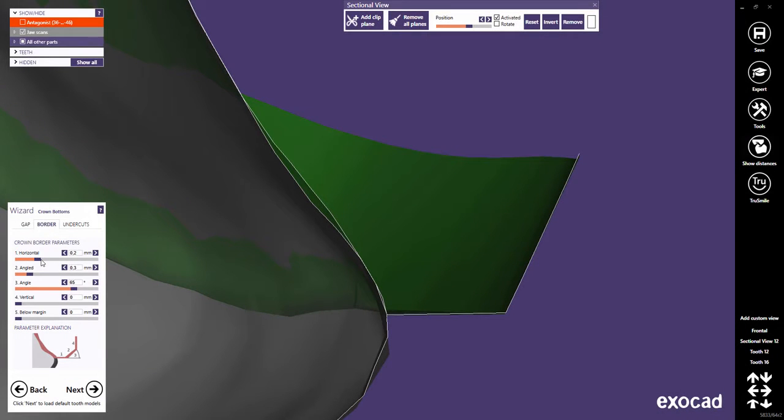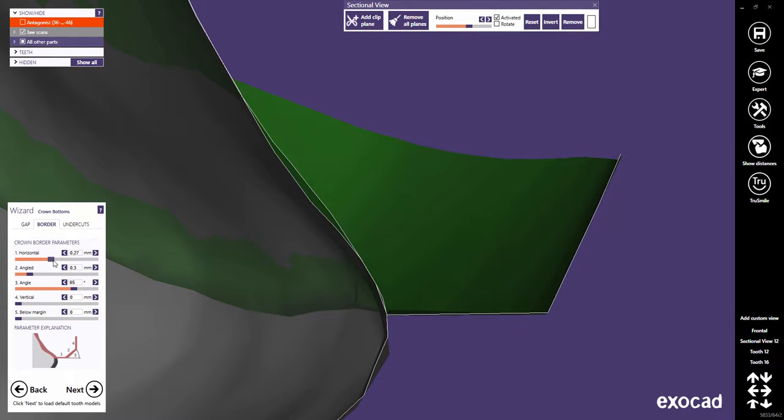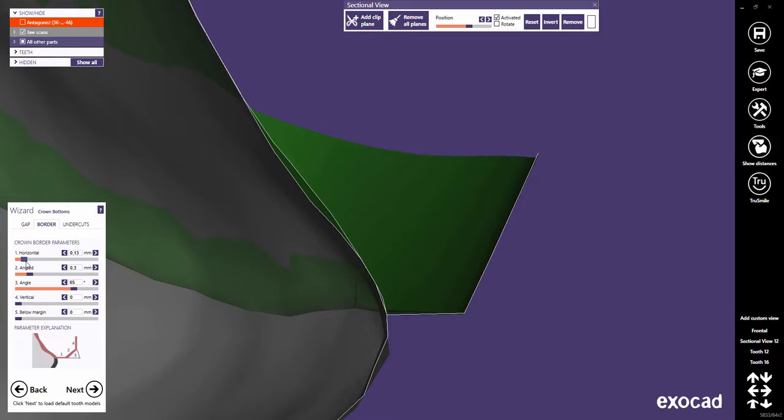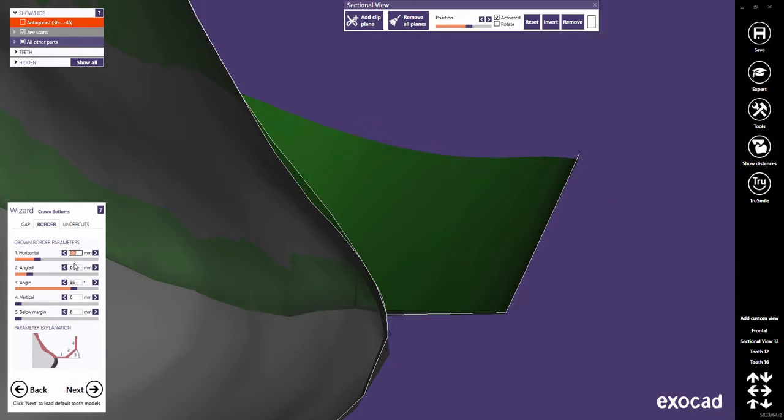Horizontal defines the horizontal crown border width. Typically, material properties enforce certain limits here. For example, for zirconia, the common minimum value is 0.2 millimeters.